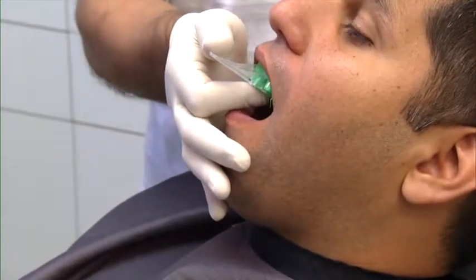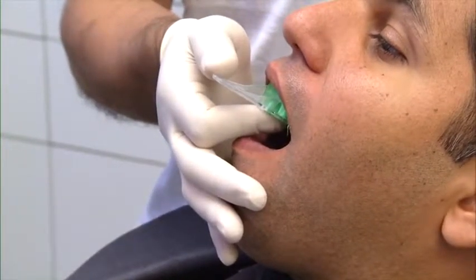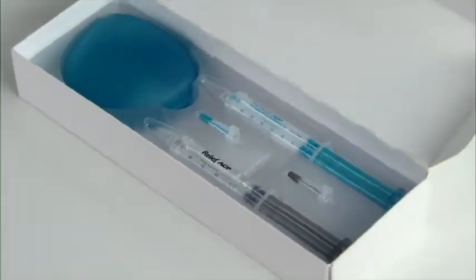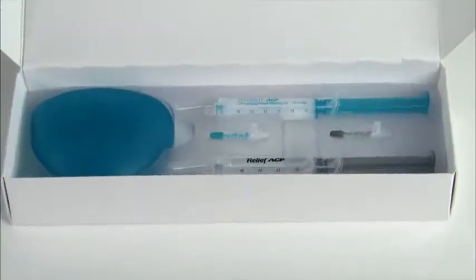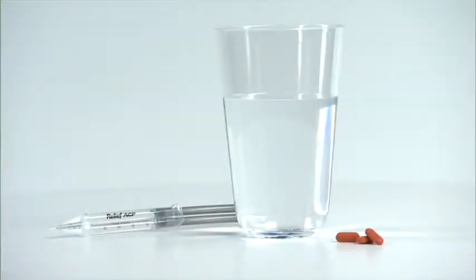Section 4, Pre-Procedure and Preparation. During the consultation appointment, impressions can be taken for custom-fitted trays. When complete, trays should be placed in the tray case provided in the patient post-care and maintenance kit. Also during this appointment, the previously mentioned sensitivity protocol can be recommended to increase patient comfort during and after the procedure.